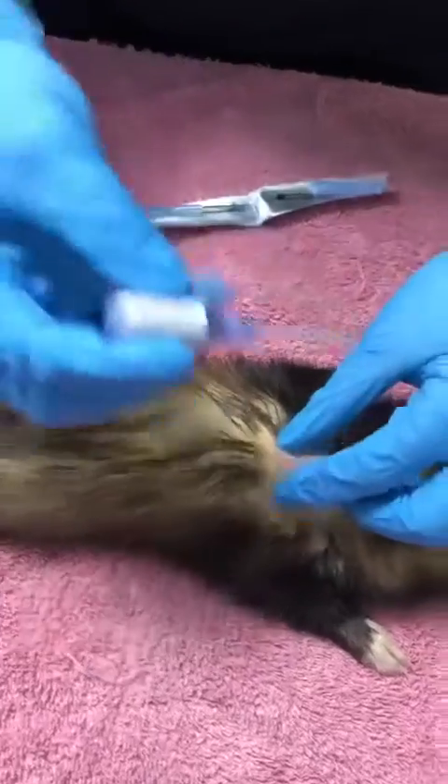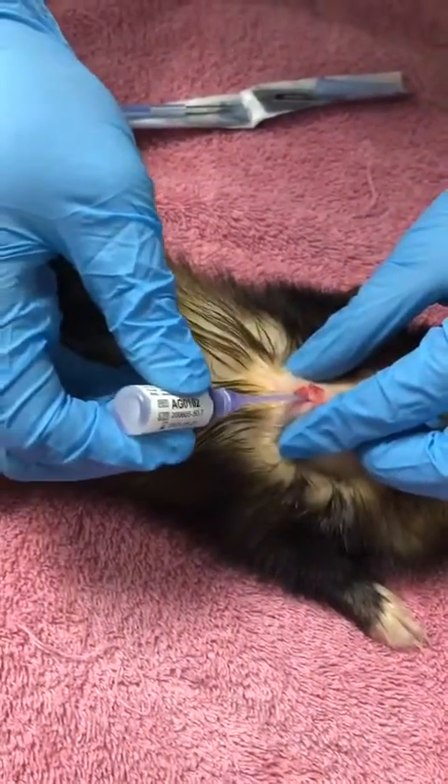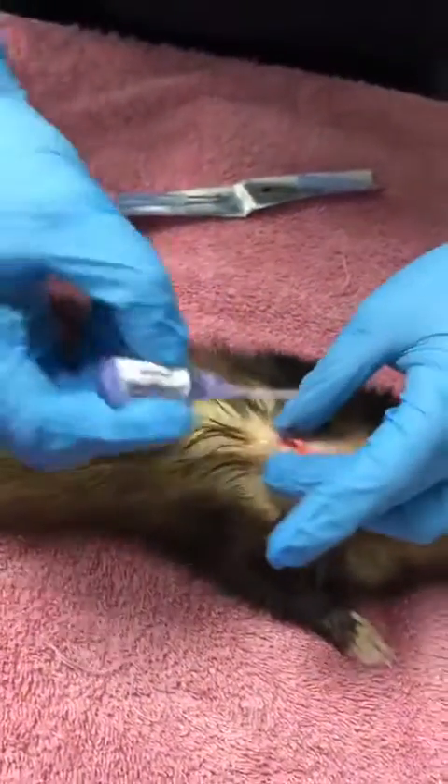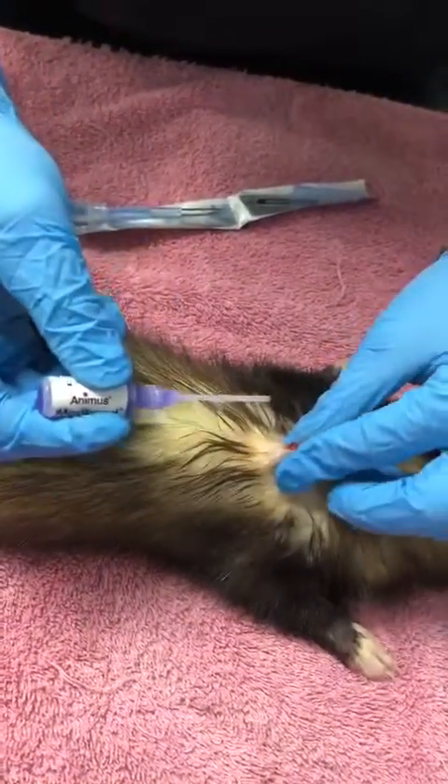Then just the tiniest little bit of glue just to close that up. Sometimes there's a small amount of blood, but it's only the tiniest little amount — nothing to worry about.